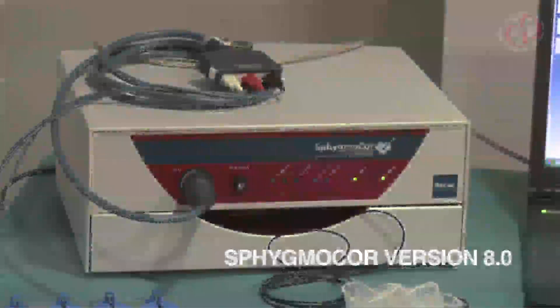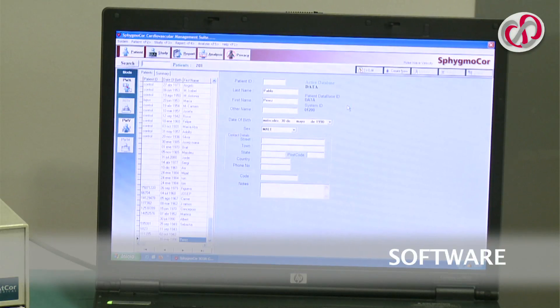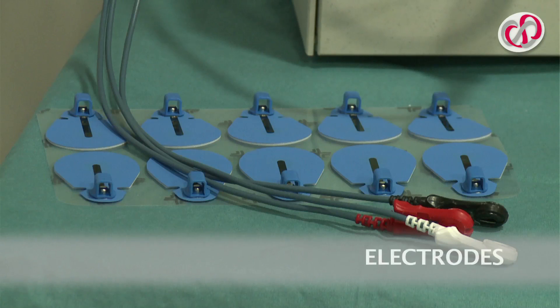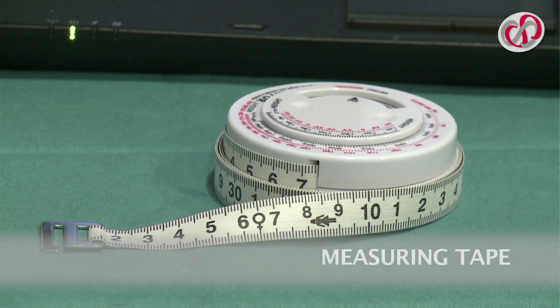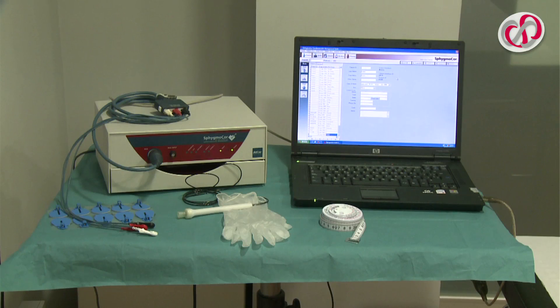This test requires a SphygmoCor version 8.0 or similar, with the accompanying software, a tonometer, electrodes, a measuring tape, gloves, and a room temperature between 21 and 24 degrees Celsius.